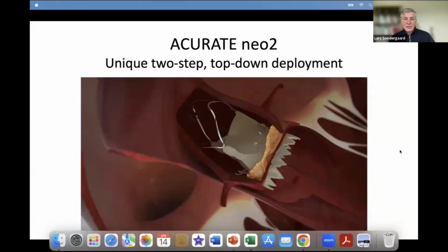So Magnus, ultrasound-guided puncture of vessels, I guess that's the state of the art everywhere. Yeah, no more poke and hope technique. No, no. And it's probably also one of the explanations why we see much less severe vascular complications than you and I did when TAVI was launched years back. It's certainly not the same. So let's see the first part of the recorded case. This is about the ultrasound-guided puncture.